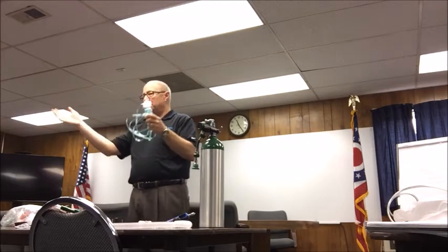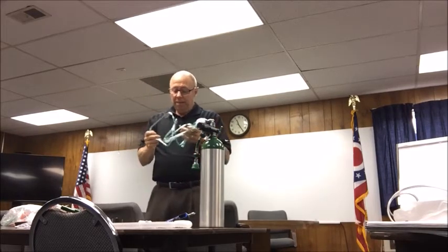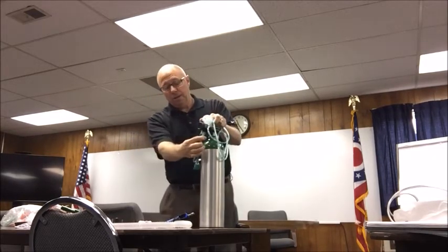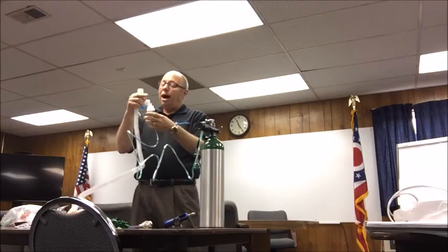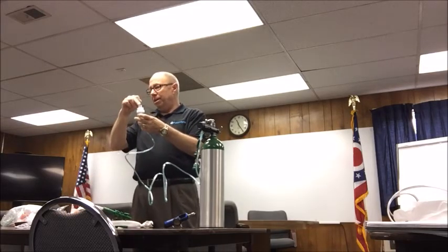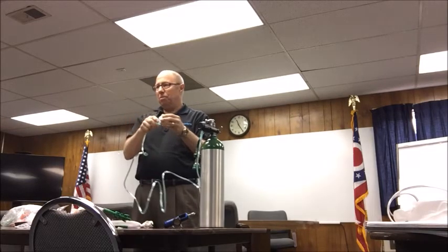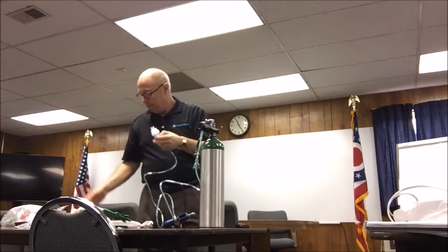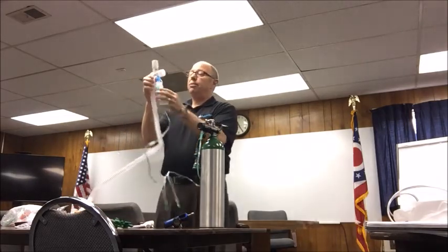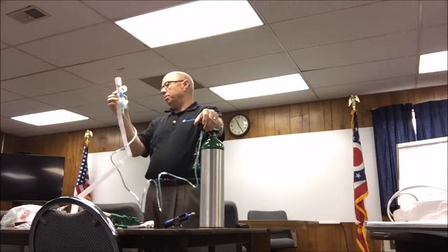This will come in a plastic bag. If you don't nebulize, you can repurpose it. You can leave it in the hospital bin or some of your citizens, whatever. So to nebulize, all you really have to do is hook it to the same regulator. I am a big believer in taking your medicine and dropping it in the top. Nothing ever good happens at 3 o'clock in the morning when I unscrew this thing. Things just go everywhere. Okay? Just drop the medication in the top. Insert it, give it a quarter turn, it locks it in. Turn my regulator to 6 or 8, deliver whatever your protocols are, and I'll nebulize.